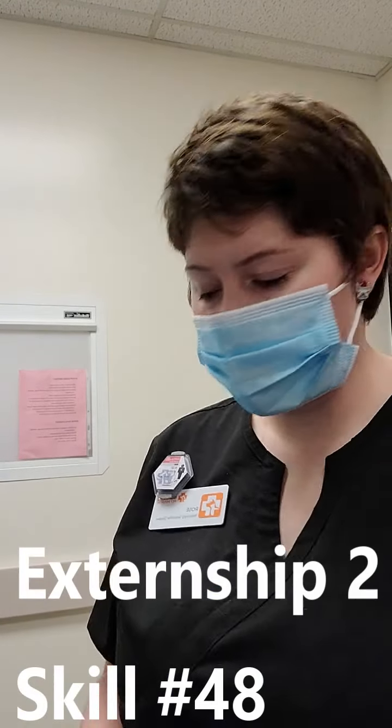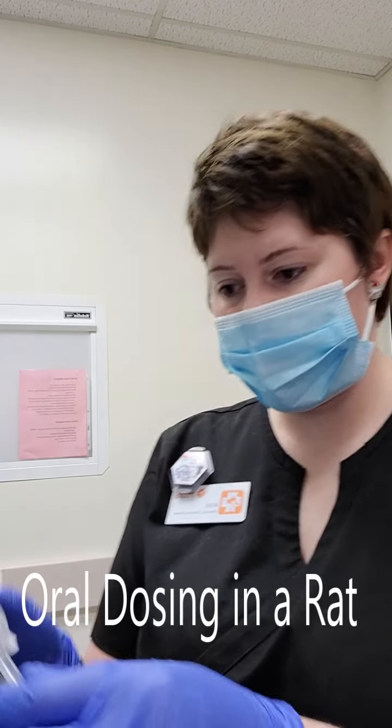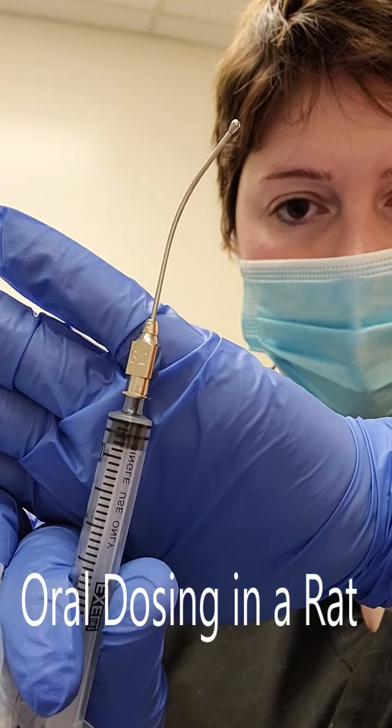Hello, my name is Rose Murray. I'm going to be doing the rodent gavage where I do the tube feeding. I already have my syringe and I'm using an 18-gauge feeding tube.